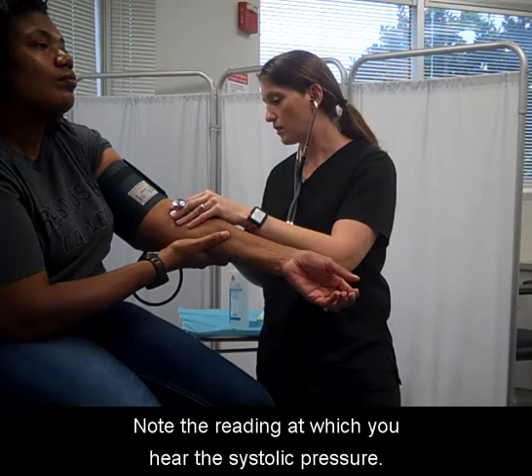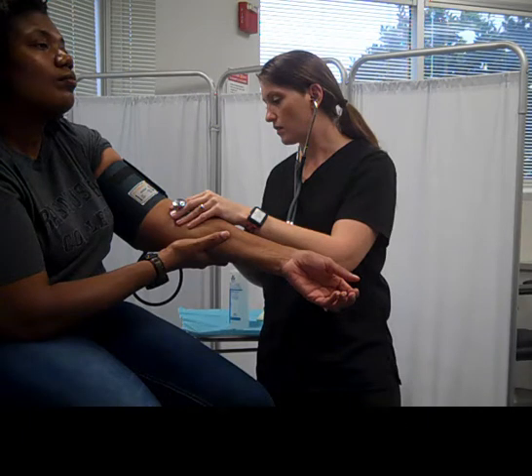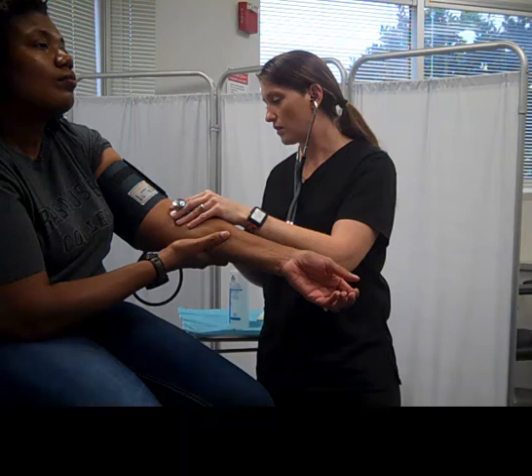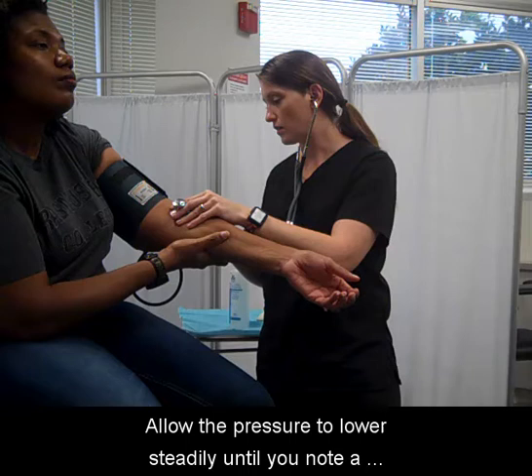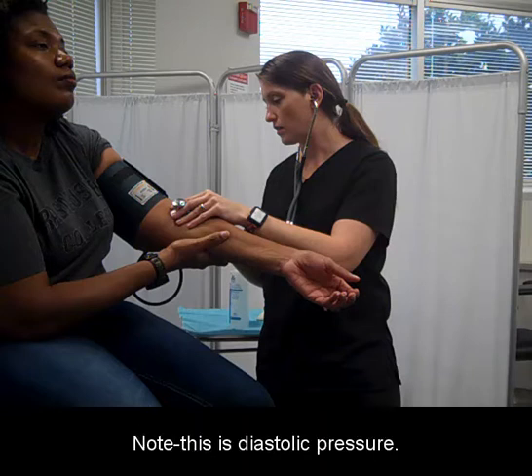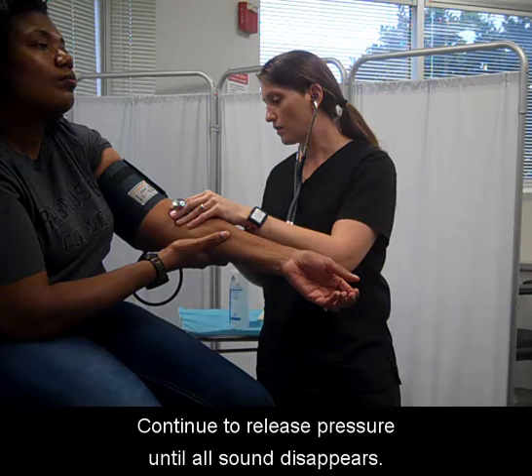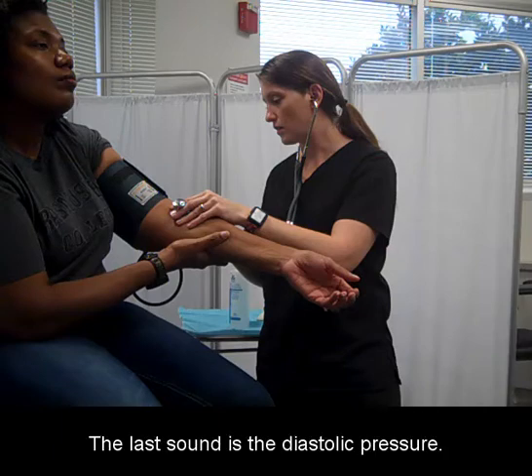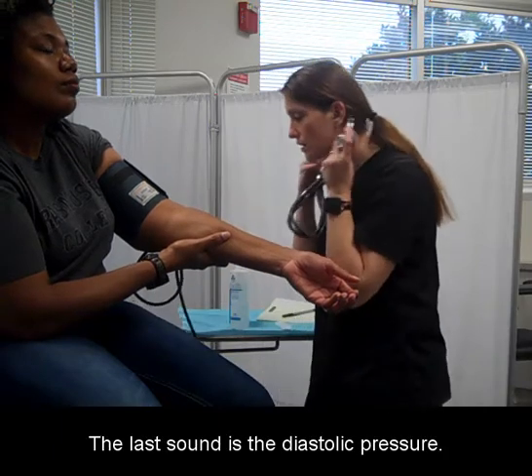Note the reading at which you hear the systolic pressure. The first noise that you hear typically is the systolic pressure. Allow the pressure to lower steadily until you note a change in sound to a softer, more muffled sound. Note this as diastolic pressure. Continue to release pressure until all sound disappears — the last sound is the diastolic pressure.